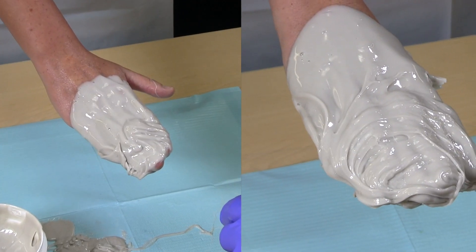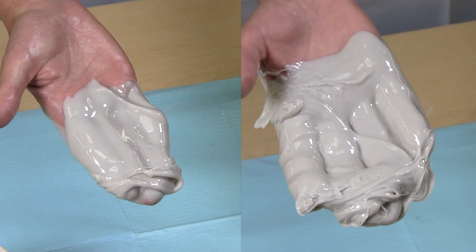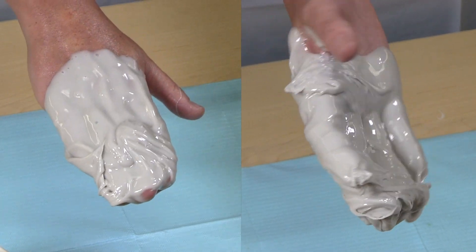Note the strained fingers, holes and poor coverage in the bad impression on the left as compared to the natural pose and good coverage of the impression on the right.